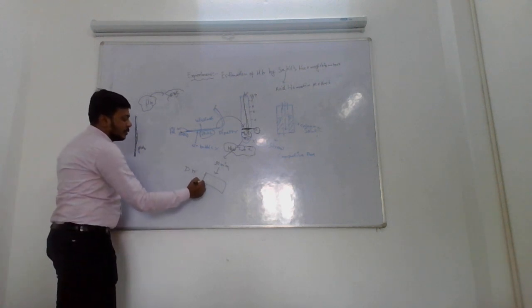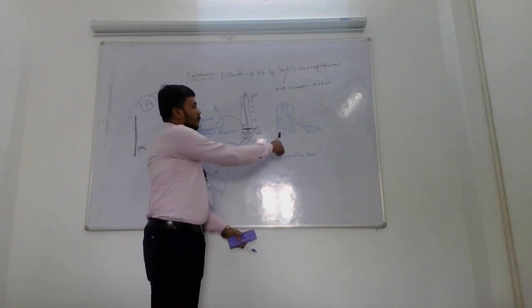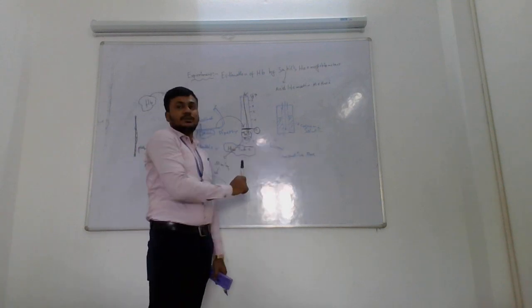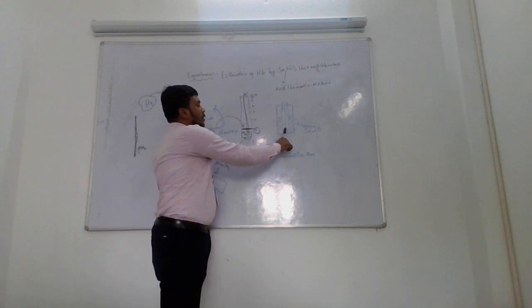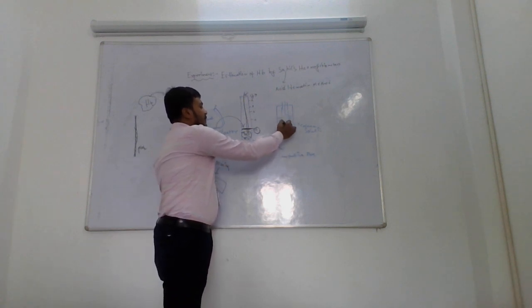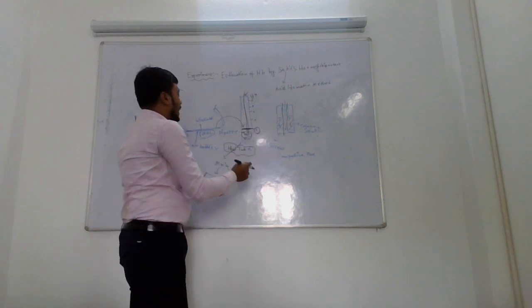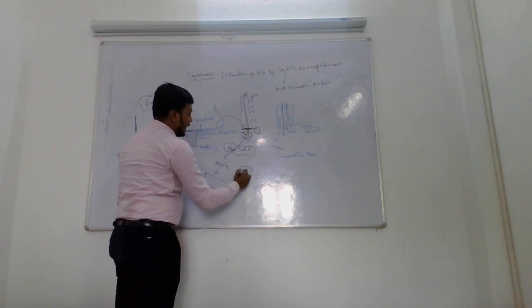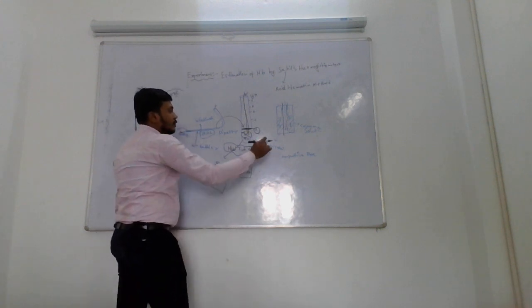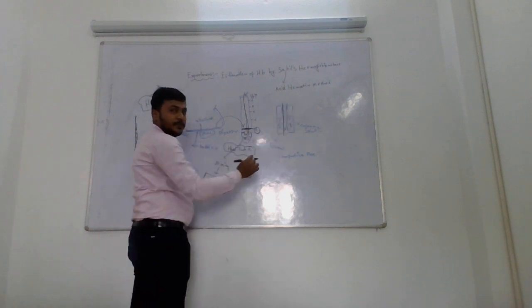What is the purpose of the distilled water? Previously I said we have a comparator box with two colors on the two sides, and the middle portion is open for inserting this tube. Now I have to check how much water to add to match these three colors.